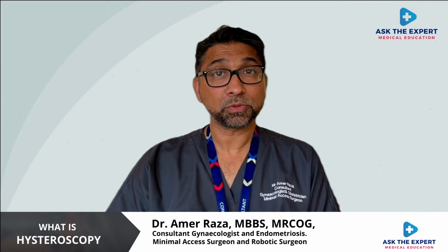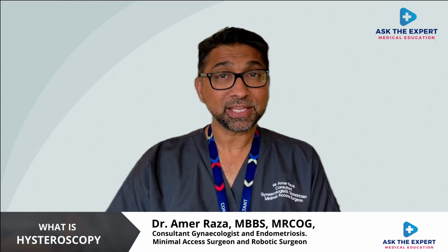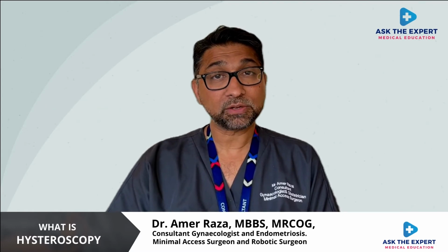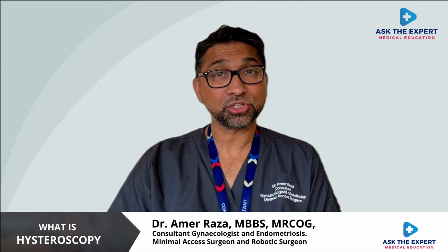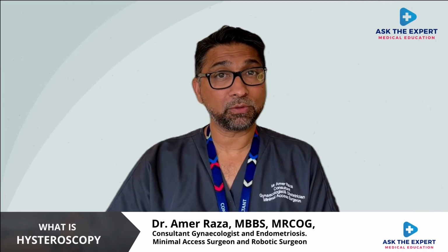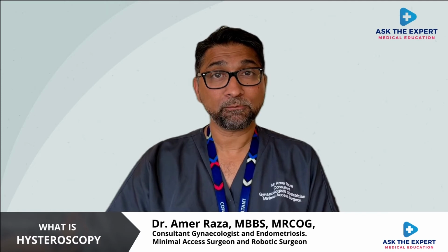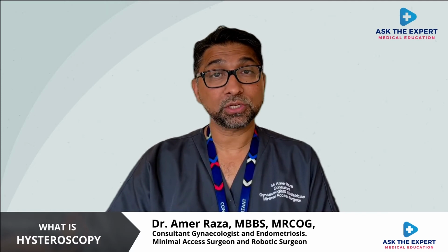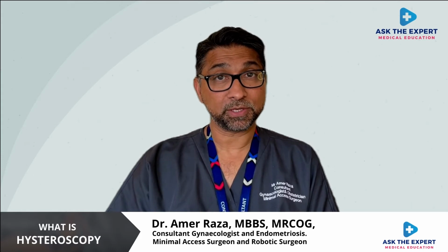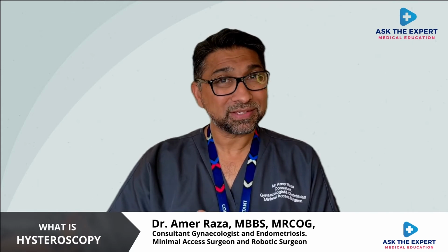One of the most important factors in outpatient hysteroscopy is the management of pain and management of expectations. Hysteroscopy is a procedure which can be painful for some women and can also have a degree of discomfort. I always advise my patients to take pre-procedure treatment with paracetamol and ibuprofen. Different hospitals will use different management for pain, but having some pre-procedure pain relief is a better option. Once you see your specialist, you may have other options also, such as intraoperative pain relief with lignospan to numb the cervix.